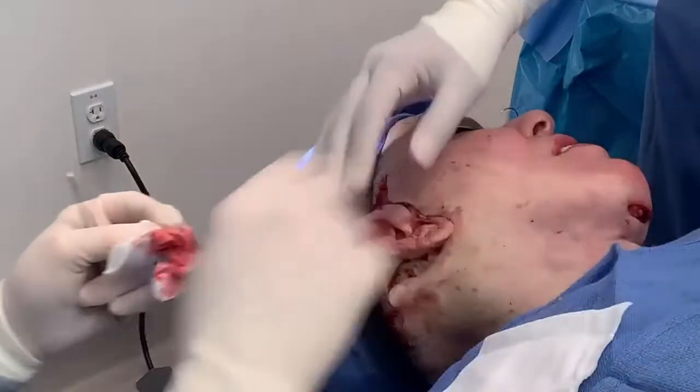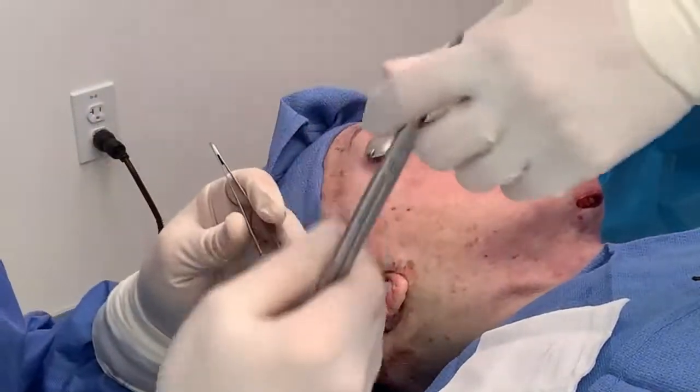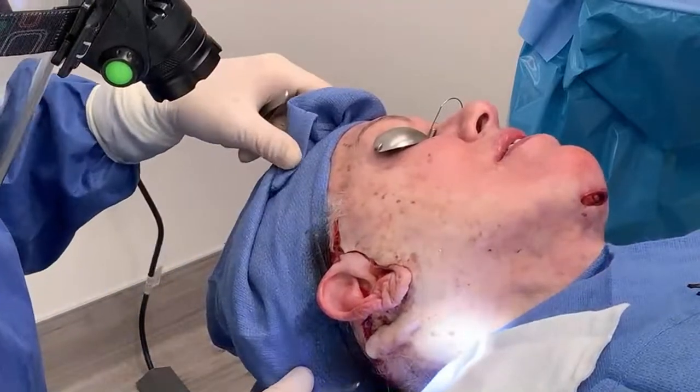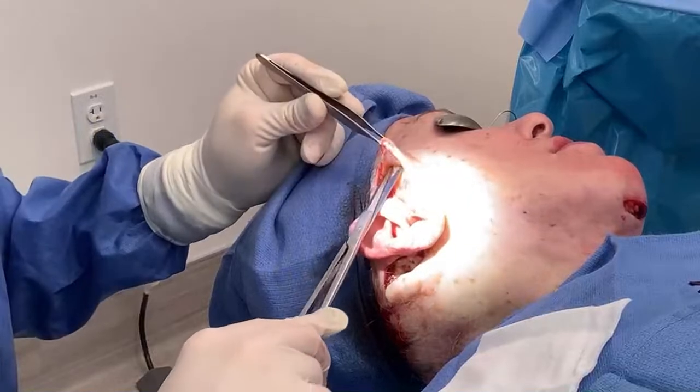Okay, release please. Very good. Thank you. Now, that was the skin on the right. Yes? All right. Yes, that's correct. We're going to lift the skin. I'm going to turn your head a little bit this way. Very good.